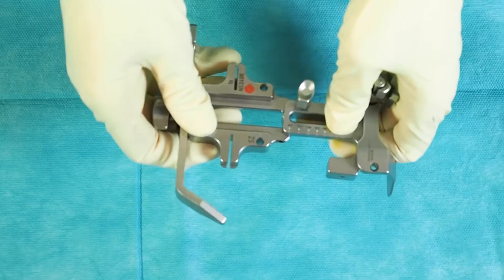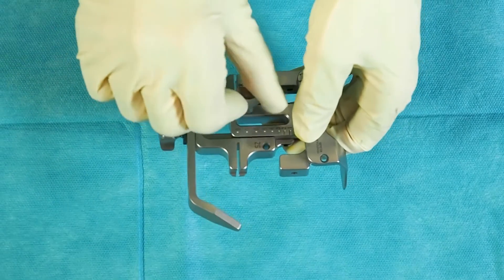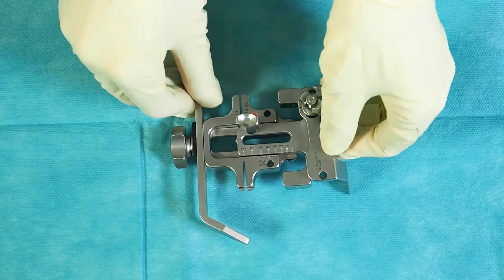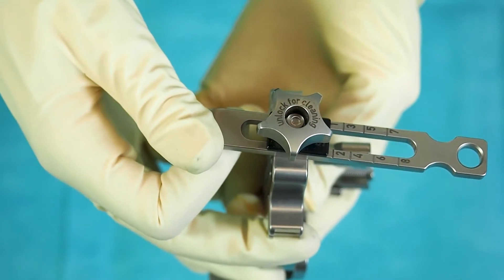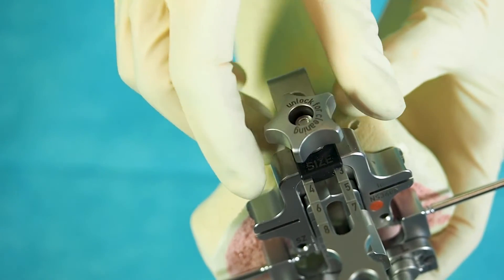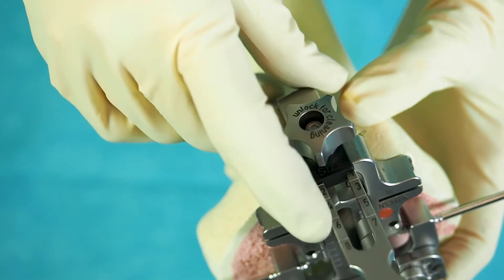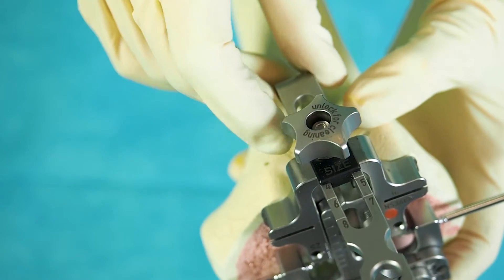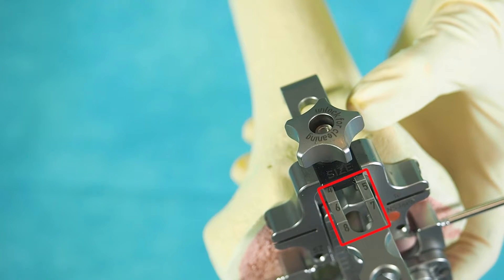Before the femur alignment block is passed to the surgeon, both parts are prefixed with the screw. The lateral anterior cortex can be palpated using the stylus to avoid the risk of anterior notching. The stylus can be adjusted in proximo-distal direction in order to get a congruence between the AP sizing and the proximo-distal sizing, indicated by the scale on the upper part of the stylus.